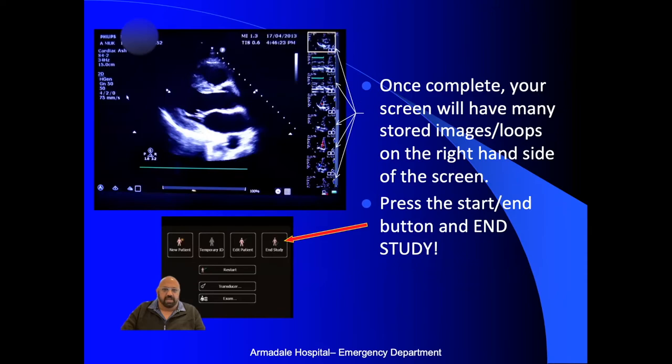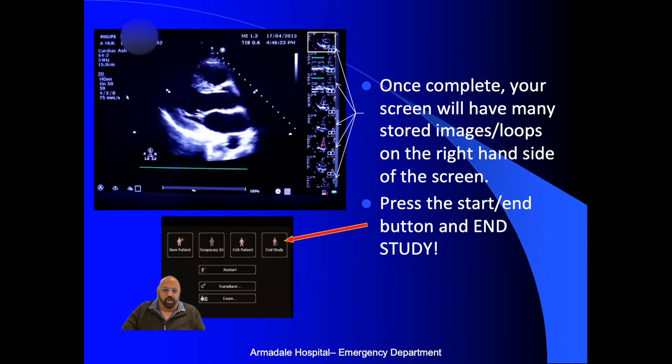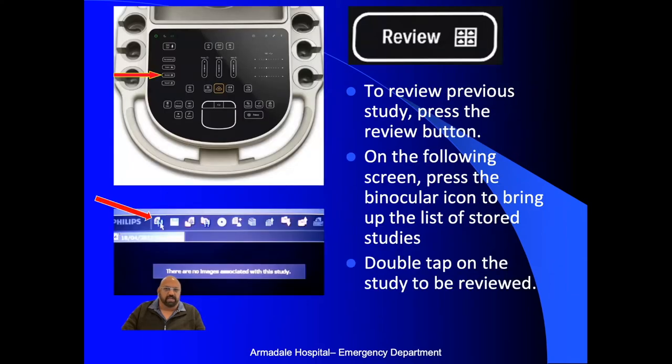Once you've completed your study, all images will come up in line on screen. Press end study so the study is completely closed before you move on to the next patient. By not ending the study, you risk the next person adding on to your scans. If you want to review after ending the study, press review, go to the binocular or magnifying glass icon, and a list of studies done will come up — click on one and all images should appear for review.